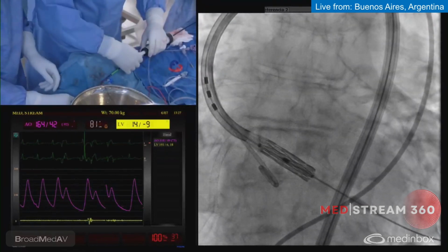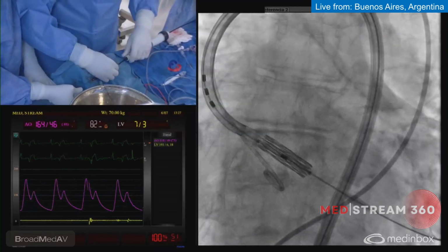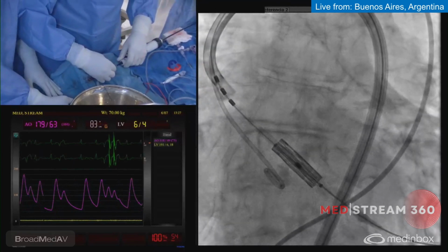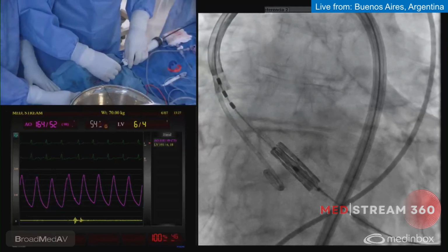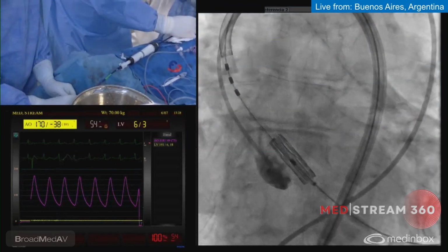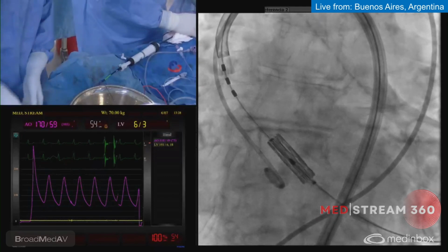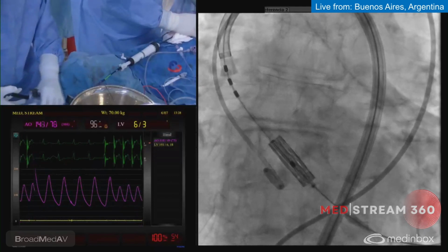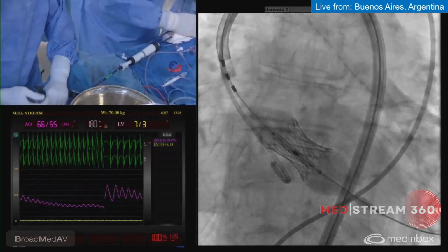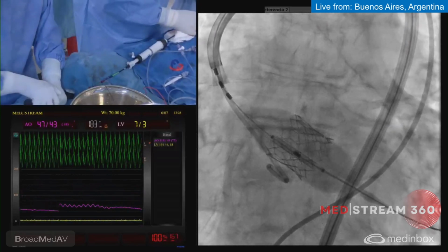Anyway, I have to unlock and retrieve the deflectable sheath until the two markers, trying not to move the valve, which is almost impossible. I have to pull a little bit more to allow the balloon a complete and free inflation. I'm going to test. Okay, I think it's okay there. So connect the pacing, 180. And we wait for a good pacing. If not, we will have to change. Okay, let's go, Carlos. Let's go, let's go. Full inflation, full. And pushing a little bit, deflate.